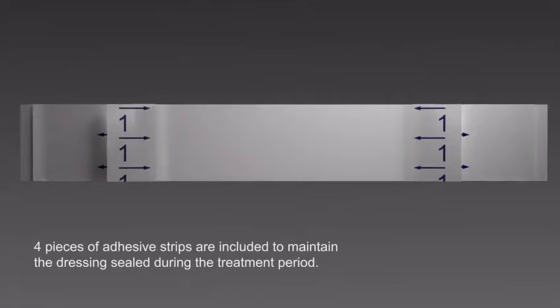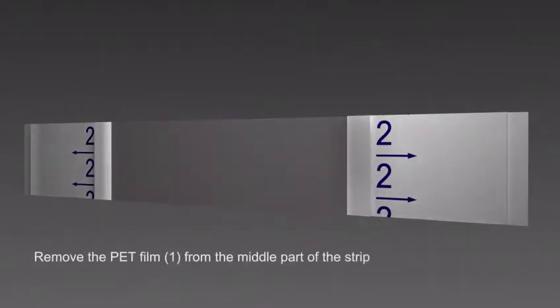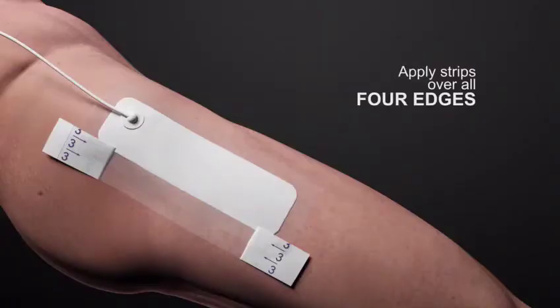Four pieces of adhesive strips are included to maintain the dressing seal during the treatment period. Remove the PET film from the middle part of the strip and apply strips over all four edges.